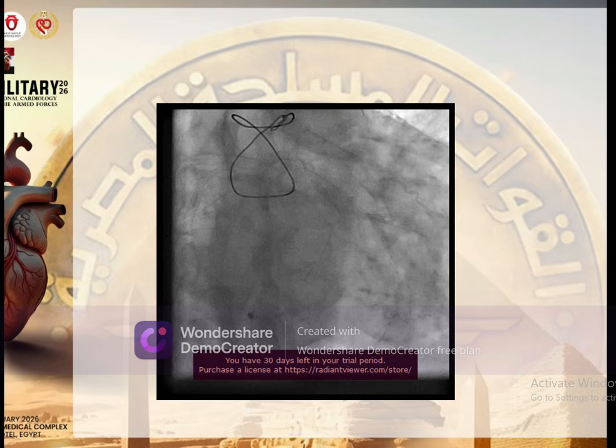One of my colleagues asked me in this demonstration whether the graft might be opened, but I told him I did a coronary angio searching for a patent graft, and the coronary CT confirmed that all venous grafts are occluded. If this is correct, then why is the circumflex giving well-formed retrograde collaterals, as we see in the previous angio?